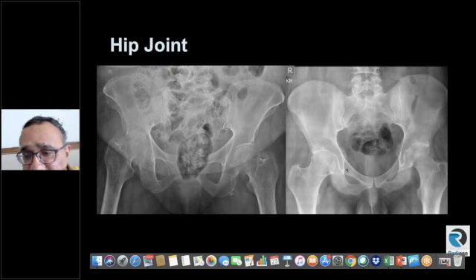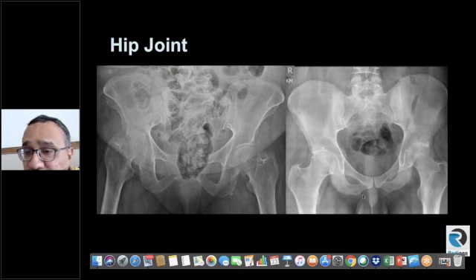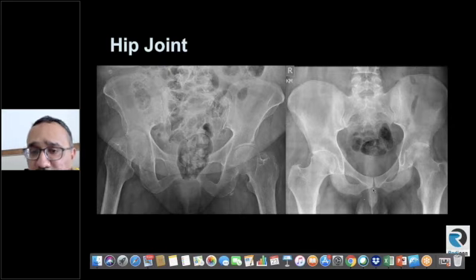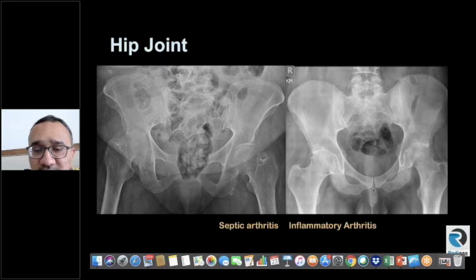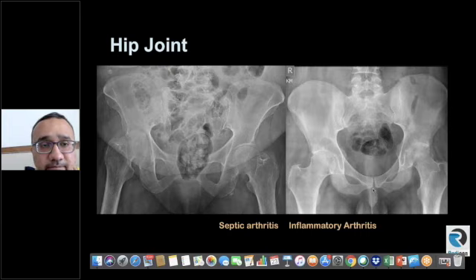Looking at the image on the right, this is a much younger patient, but again the pathology is on the left side — diffuse joint space loss. Again, think about septic arthritis or inflammatory arthritis.